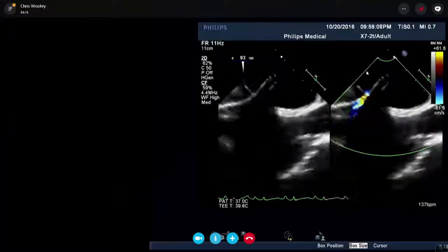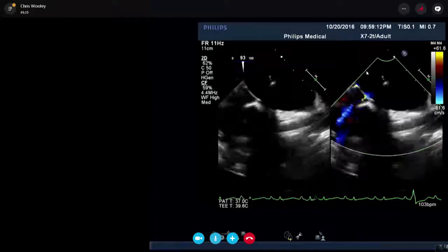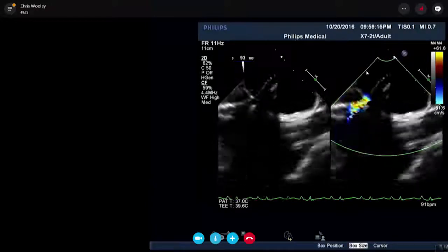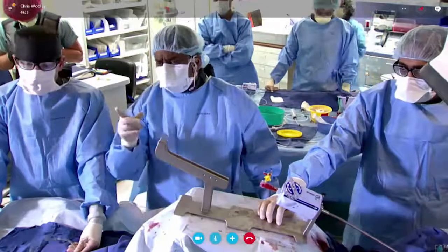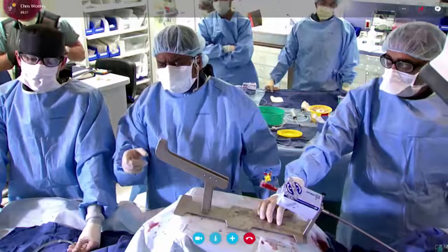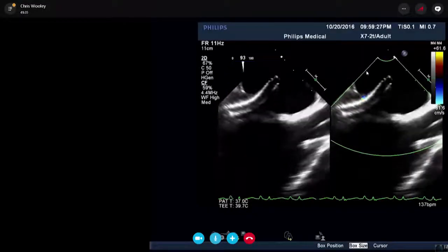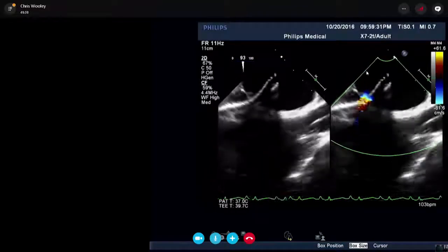We want to take the guide out. So we have seen that we've had patients who have had right to left shunts. We've had patients who've had desaturation, or the septum is torn and we have to close the septum. So now what we're going to do is, once we finish the right heart study, as we're doing now, we're going to pull the guide catheter out. The RA pressure has remained constant and the PA pressure has remained the same.